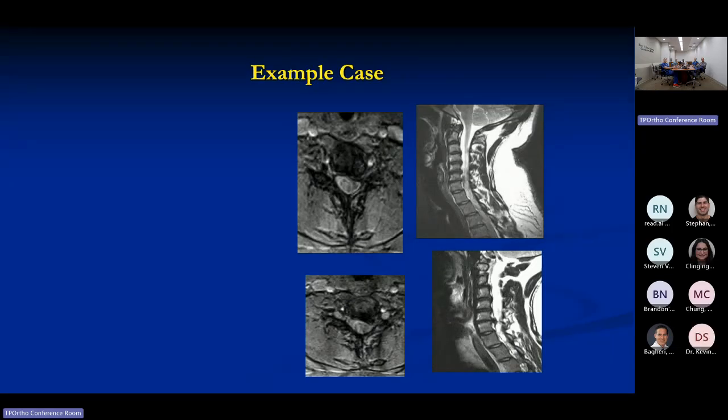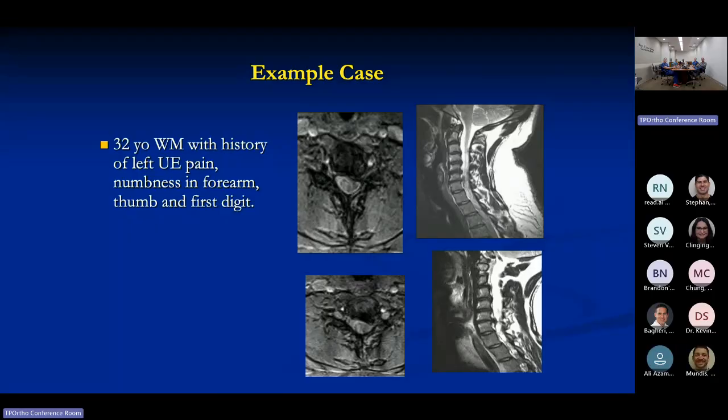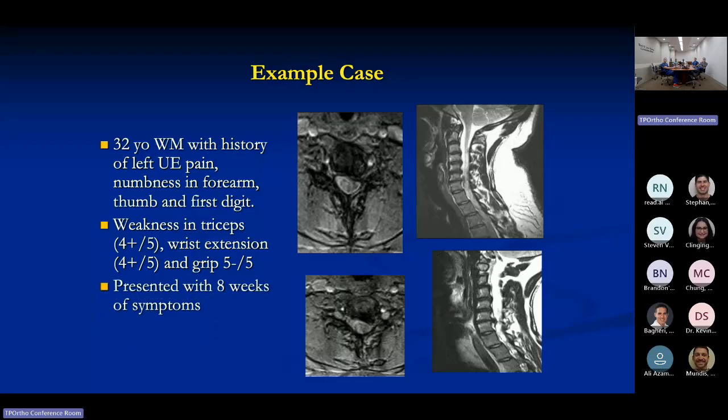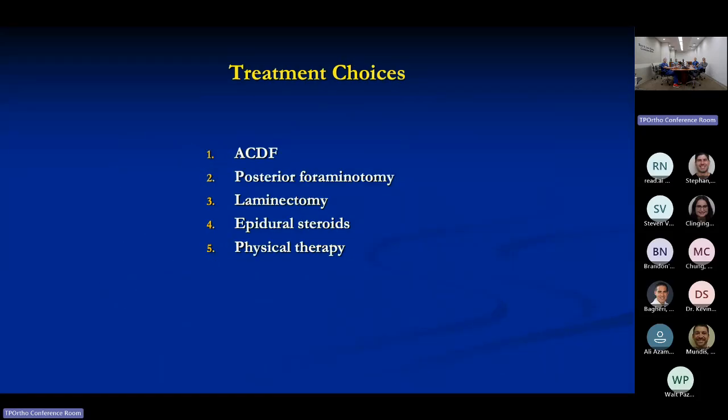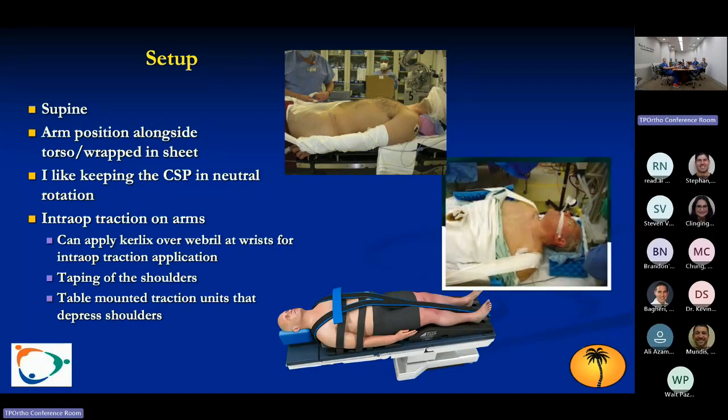So just a sample case, a young guy with what you can see is a spondylotic spine, disc herniation, little cord impact, some weakness, and symptoms that have gone on for 8 weeks. This is the typical example of somebody who's probably going to be a good candidate for an ACDF. And importantly, nowadays maybe a disc replacement, but when you have a lot of disc collapse, as you see there, probably not a great candidate for a disc replacement. So lots of options, but ACDF is where we're headed today.